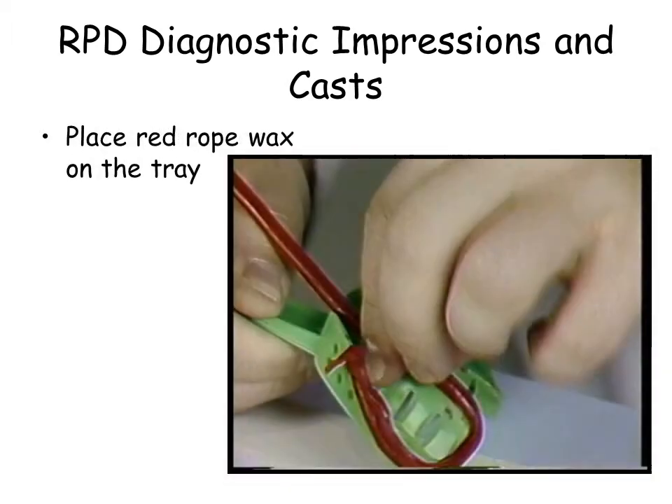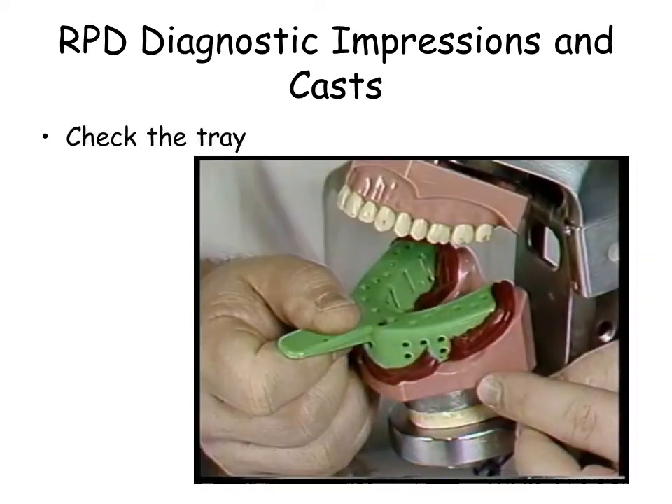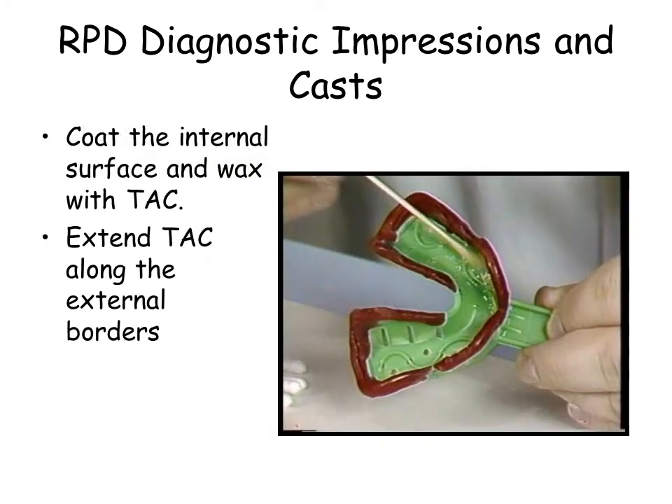Place red rope wax along the borders of the tray. Apply a liberal amount of tray adhesive to the tray, being sure to cover the lateral borders of the tray.